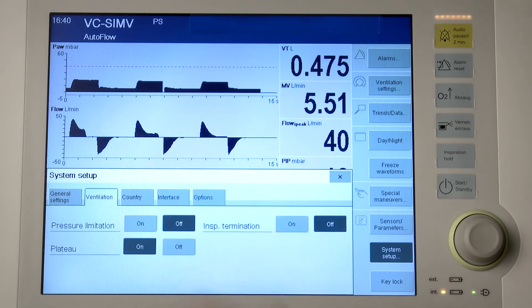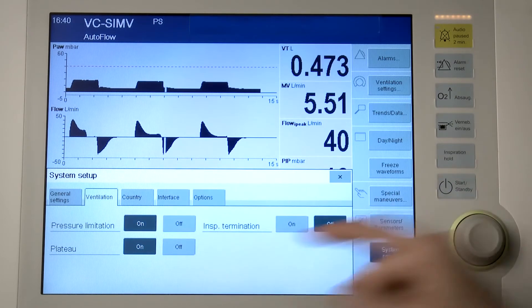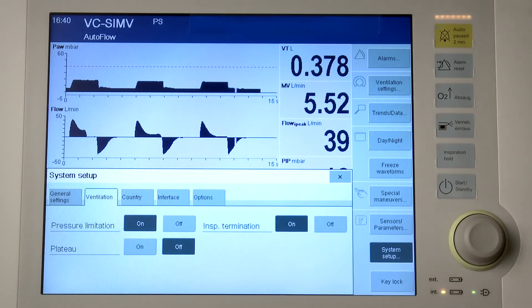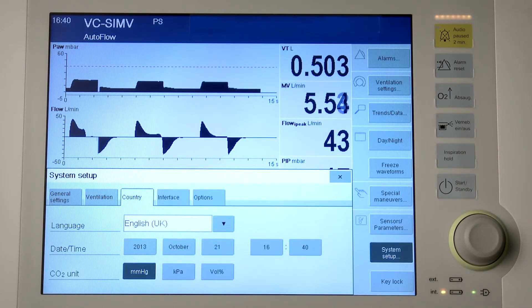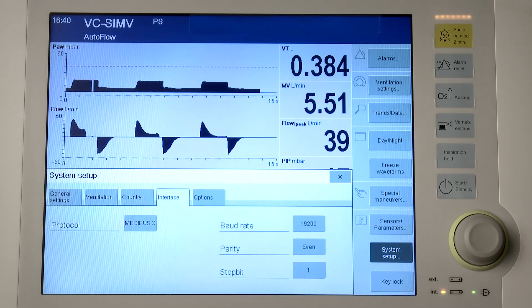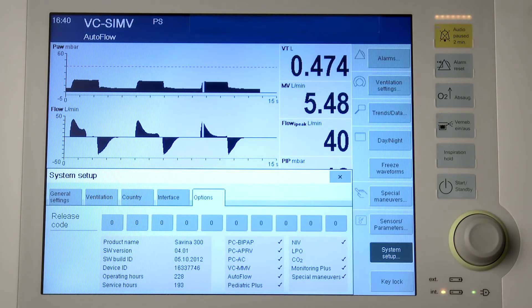On the ventilation page, the ventilation functions pressure limitation, inspiratory pause, time plateau, inspiratory termination and, if available, low pressure oxygen LPO can be activated or deactivated. Touch the on or off button and confirm with the rotary knob. You can configure a language, the date and time and the units on the country page. Data exchange takes place via Medibus or Nurse Call.